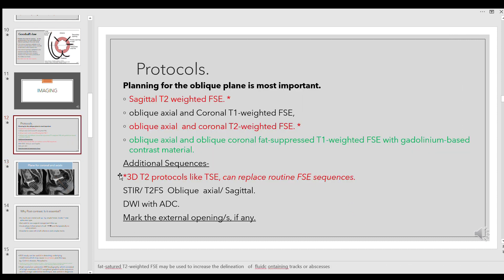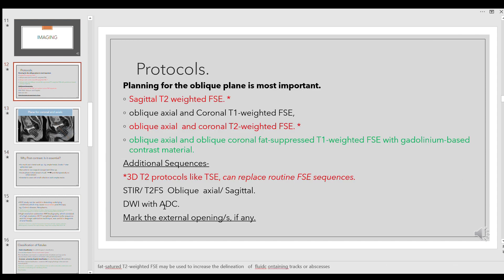Additionally, we perform 3D T2 protocols routinely — I'll show an interesting case demonstrating their importance. You can also do diffusion-weighted images with ADC to identify acute abscesses. STIR or T2 fat-suppressed images in oblique axial or sagittal planes are good for comparative study. Always mark external openings using a silicone capsule or a water capsule, and try not to insert anything into the anal canal as it is painful for the patient.